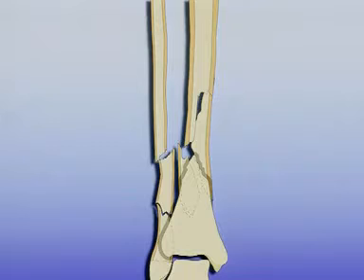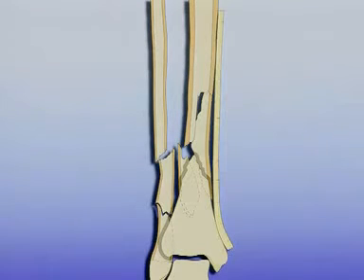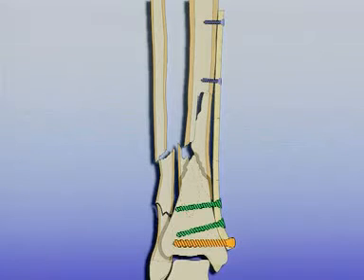First, the fracture of the tibia is stabilized. The slightly pre-contoured 4.5/5.0 LCP is primarily fixed distally, close to the joint with a 6.5 mm cancellous bone screw. After checking the correct reduction regarding length, axis, and rotation, proximal fixation is performed with a monocortical self-drilling locking head screw. Then comes final fixation, distal with self-tapping and proximal with self-drilling locking head screws.